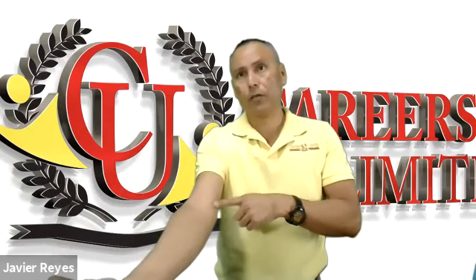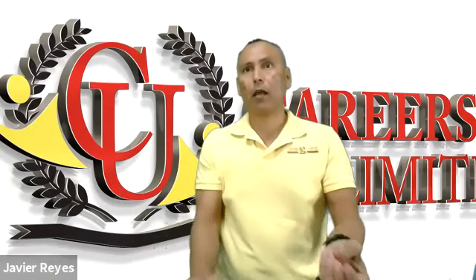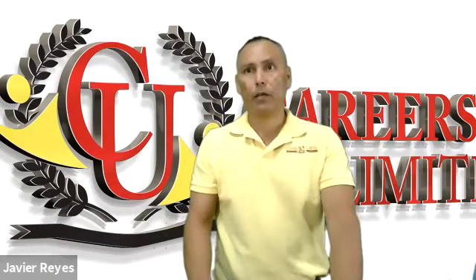If you injure this nerve, you will cause something called a claw hand. You puncture the ulnar nerve, the one that goes here, and some of the fingers will contract like that, making it look like a claw. So make sure that you don't perform blind probing around that site.